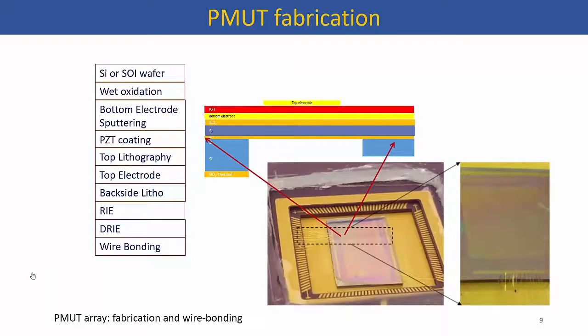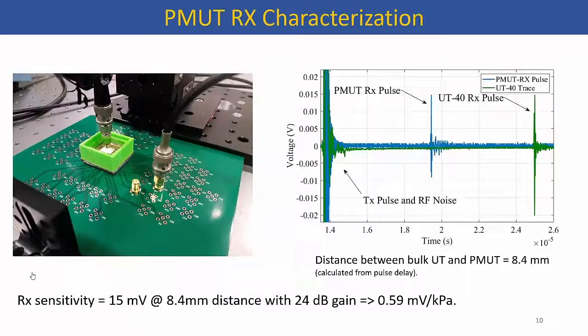The finished device looks something like this. It is integrated and wire bonded on a pin grid array. As you can see, we haven't been able to wire bond all the way and are still facing some troubles. We were also limited in the number of channels we could acquire in parallel, so going ahead I'll show that we made do with just one element to get some imaging done.